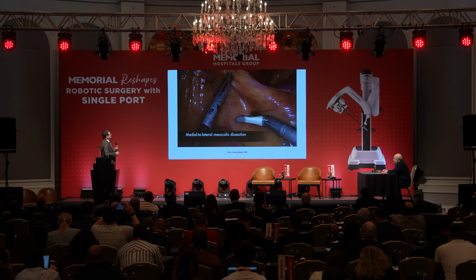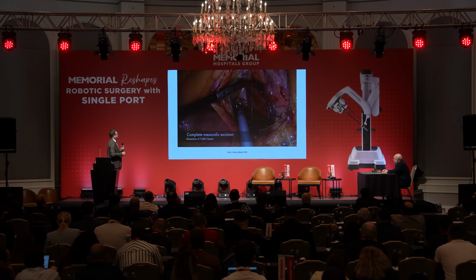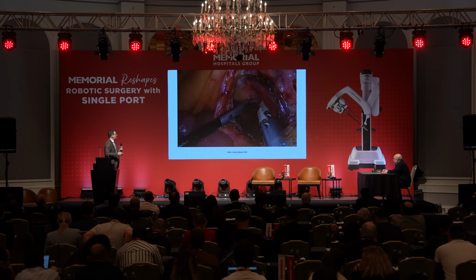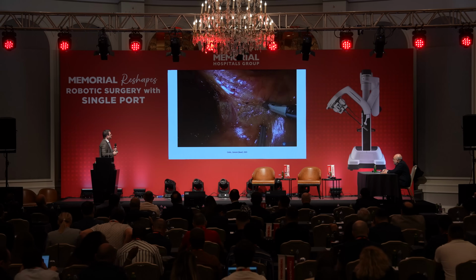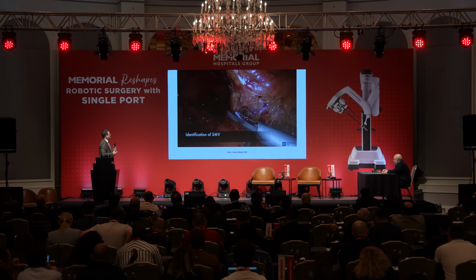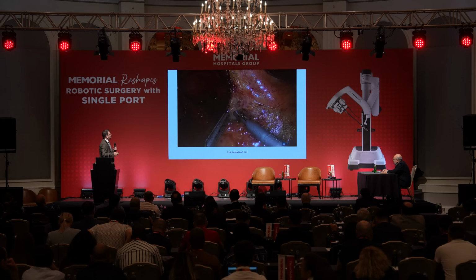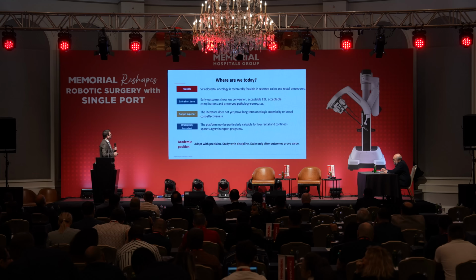And there are also some applications with perioperative imaging guidance. So application of a simple CT scan, especially for right colectomy, with all the variations, may help application of these instruments to the robotic platforms with artificial intelligence. I believe the quality of the operations will increase.